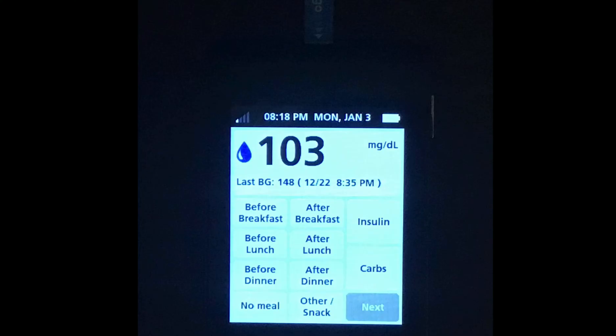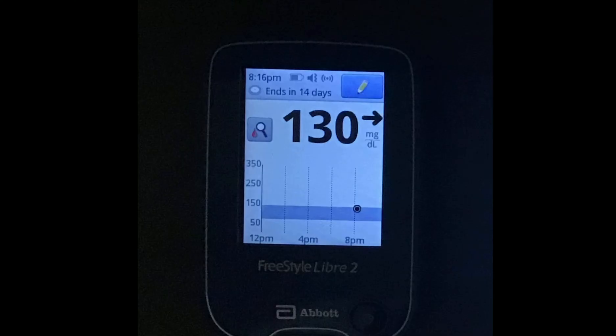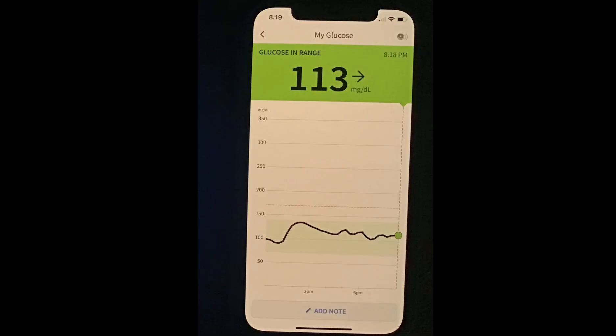So I did a finger stick. The finger stick showed me that I was 103. When I compared that to the day one Libre — the one I just had put on, which just passed its one-hour warm-up time — it showed me that I was 130. That was off by 27 points, which is a pretty significant amount. Then when I checked with my day 14 Libre, which only had a few hours left, the blood sugar was actually 113 — only off by 10 points, which is very minimal.